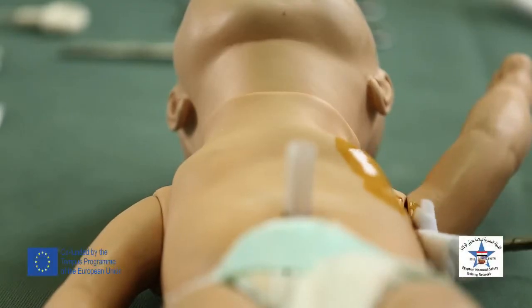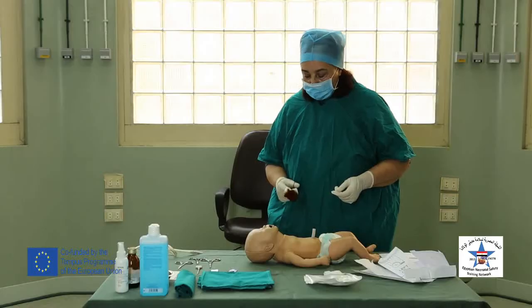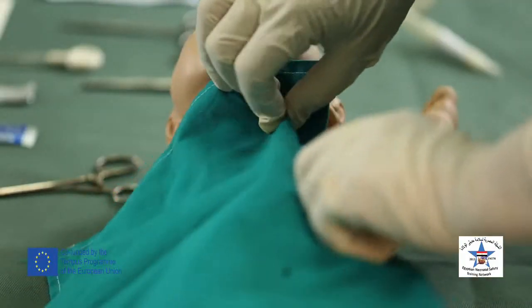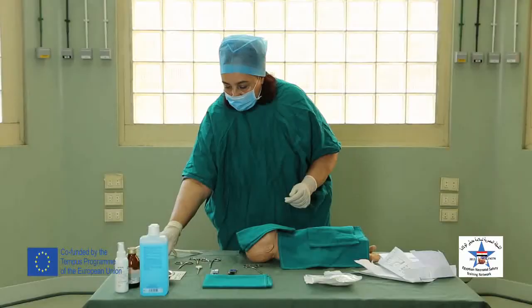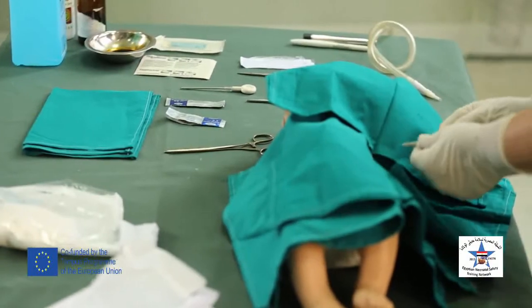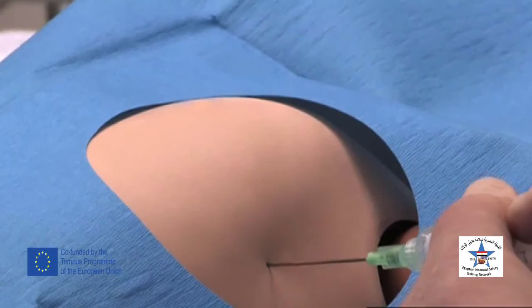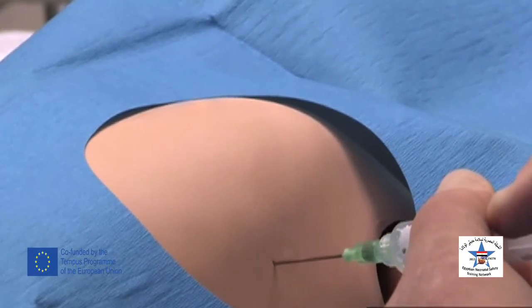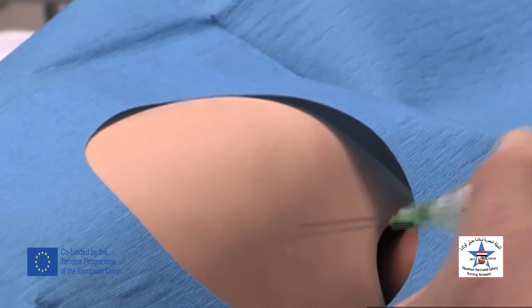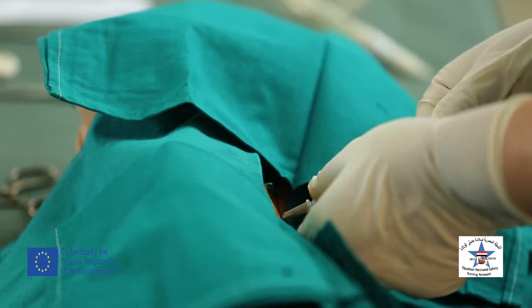I will sterilize the area with an appropriate antiseptic solution and leave to dry for a few seconds. And then I will put my sterile dressings. I will then give a local anesthetic, lignocaine 1%, penetrating the skin, and then subcutaneous tissue and the intercostal muscles surrounding area.